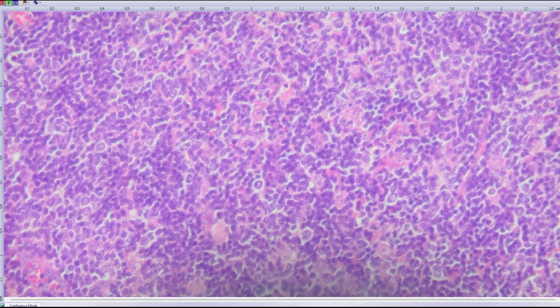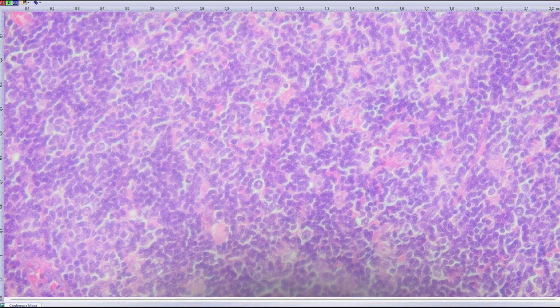single cells with very large nuclei and nucleoli, and around them we see a sort of lymphocytic rim, a rosette created by lymphocytes. These are typically follicular helper lymphocytes, which are positive for PD-1, for example.